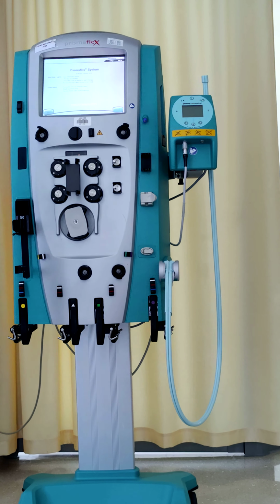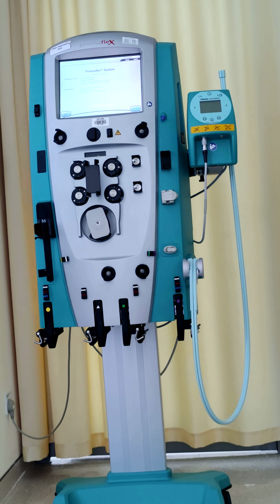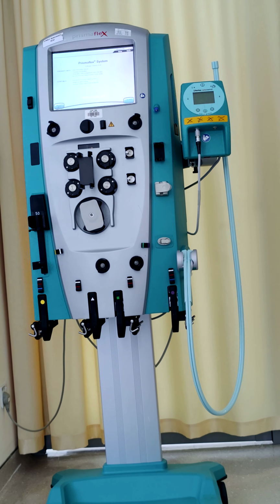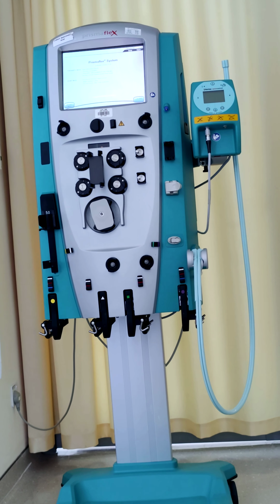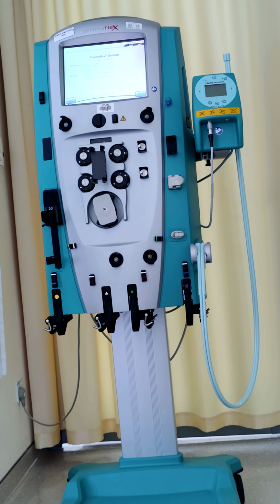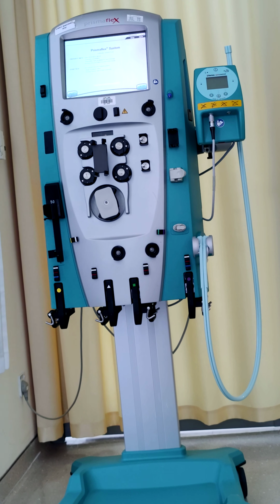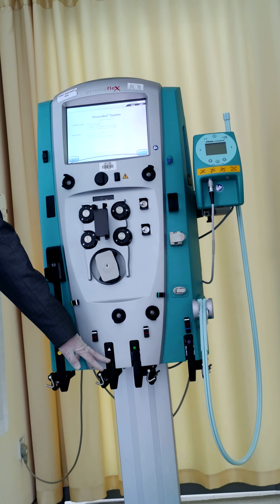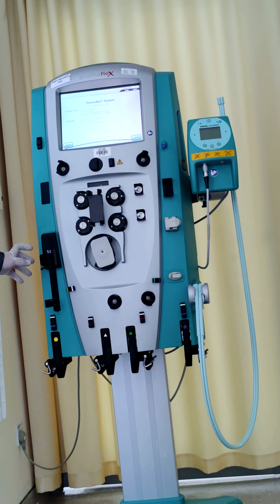But you have to know something: if you are using complete plasma, the risk of clotting is very high, and in some situations you cannot complete the session with one filter. Even if I use heparin? You have to increase the blood flow a little, because increasing the blood flow decreases the possibility of clotting. You can increase the blood pump rate this way. You can also use a continuous heparin dose.